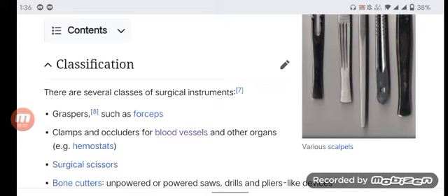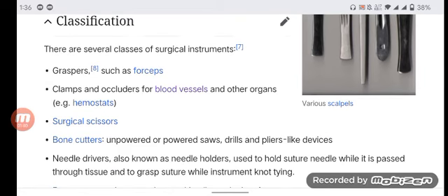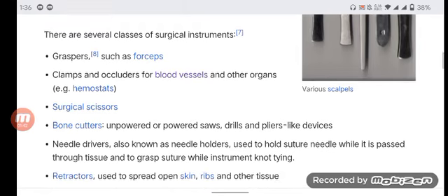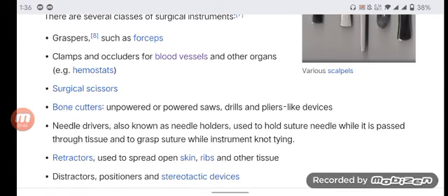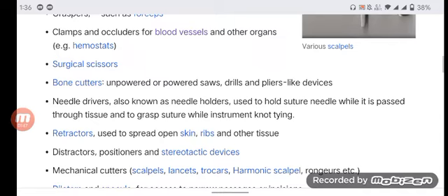There are several classes of surgical instruments. Graspers such as forceps, clamps, and vulsellums for blood vessels and other organs; surgical scissors; bone cutters; unpowered or powered saws; and drill and blade-like devices.